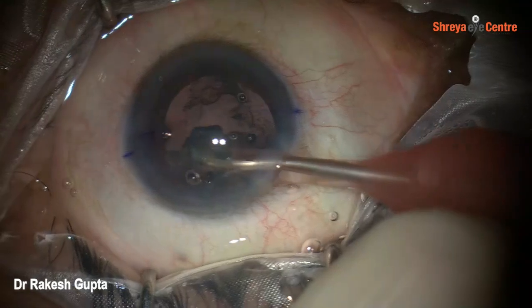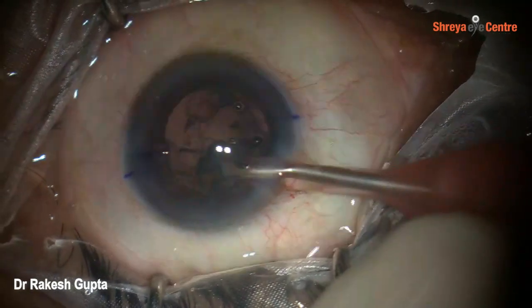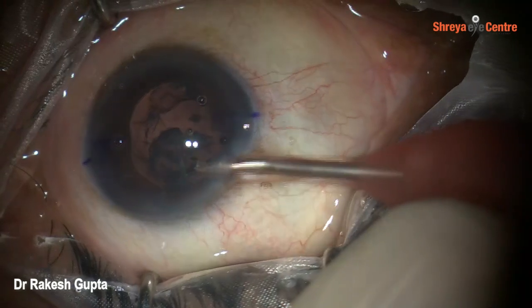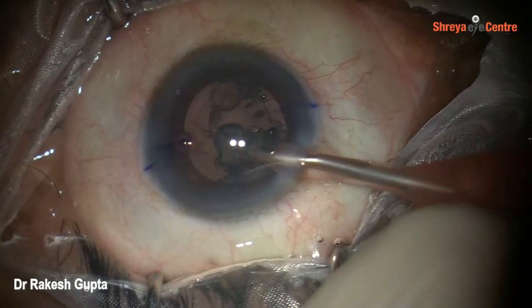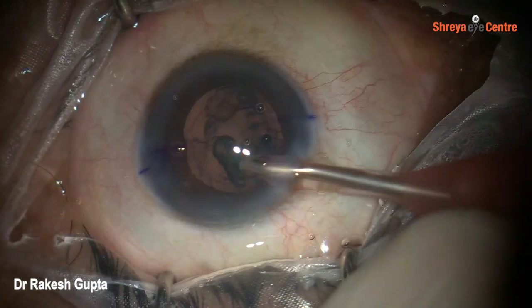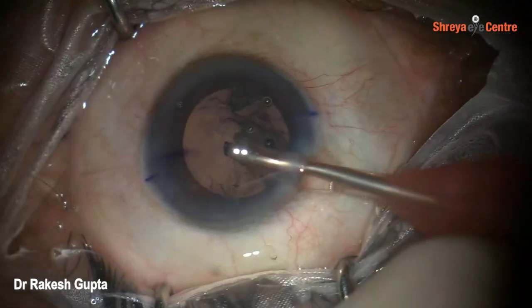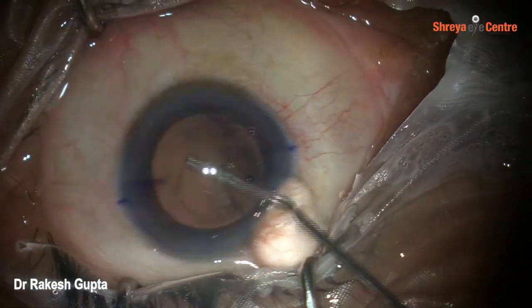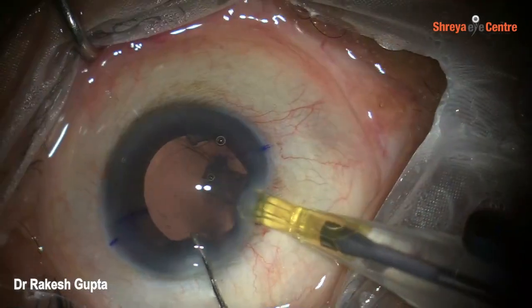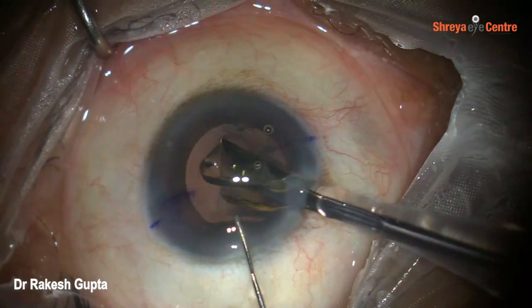If I am able to remove this last remaining part of the cataract and there is no extension of the PC rent, then I will be able to prevent even the need for anterior vitrectomy. As you can see here, the PC rent has not extended, and now you can see I am injecting methylcellulose in the bag. There is already dispersive viscoelastic present in the bag, so it becomes a kind of soft shell technique, where there is a periphery of Viscoat along with methylcellulose in the center.